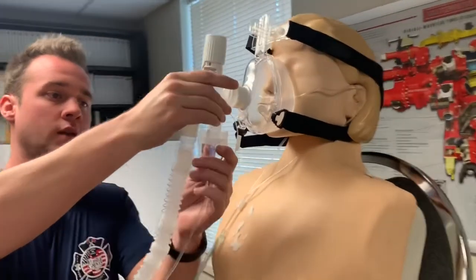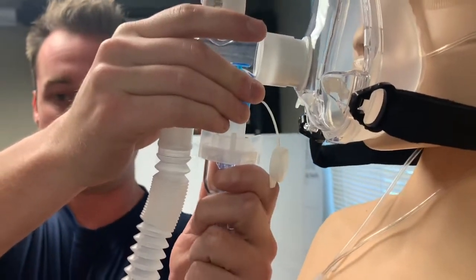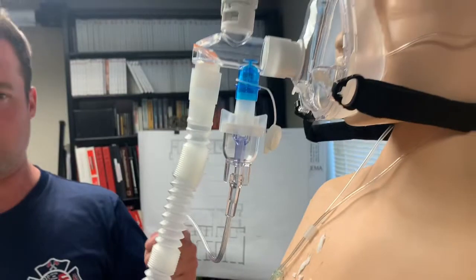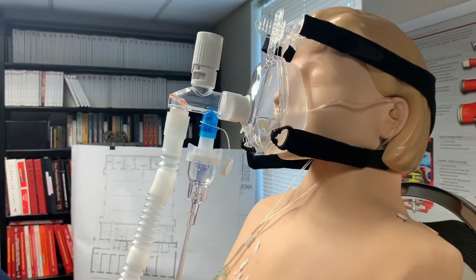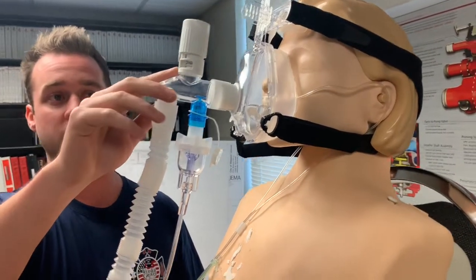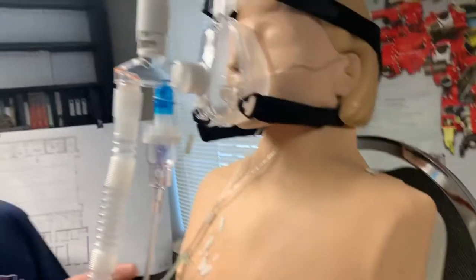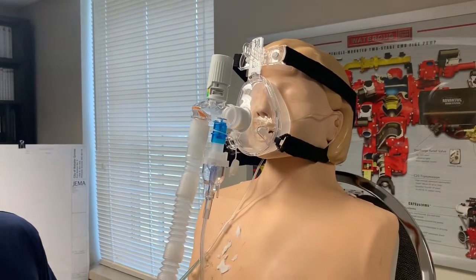And once you do that, you just simply connect the nebulizer right here, and we have oxygen flowing at 6 liters per minute, and the patient can get the benefits of CPAP from positive end expiratory pressure as well as the benefits from the medication, and we can hope to see an improvement from there.